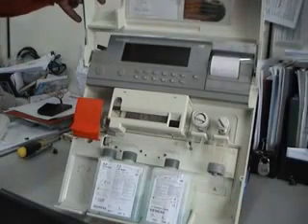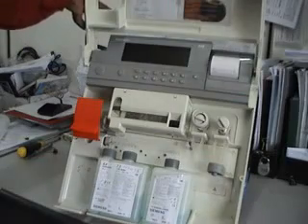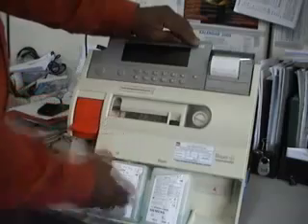Hello, now I am going to give you a demo on how to clean the solenoid valve. This one is a model 348 ABG machine.